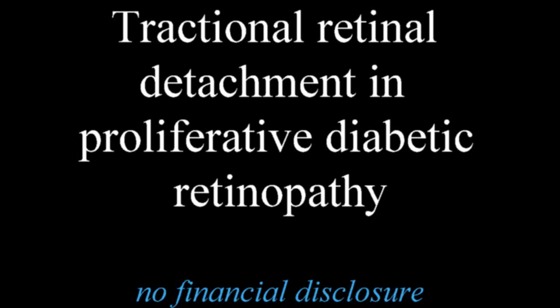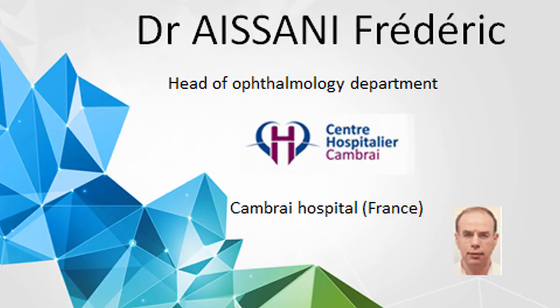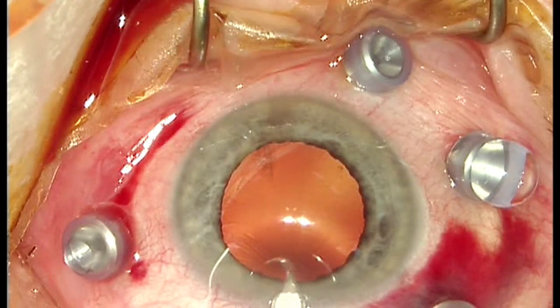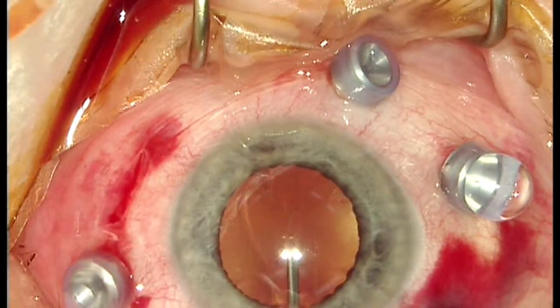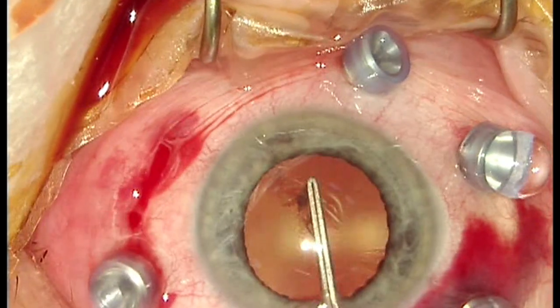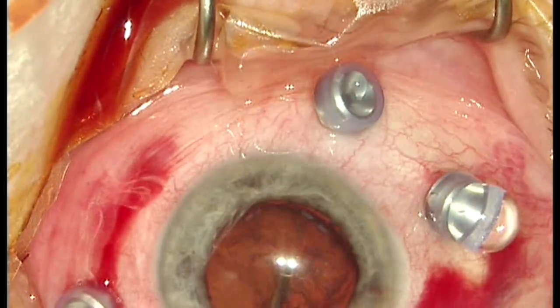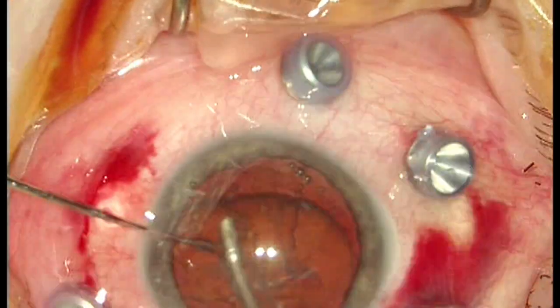This 63-year-old woman with type 1 diabetes mellitus complains of blurred vision since one month. One eye has been operated by our team in emergency because of neovascular glaucoma one month ago. We operate now on the other eye. Visual acuity of this eye is reduced to light perception, with retraction and retinal detachment.